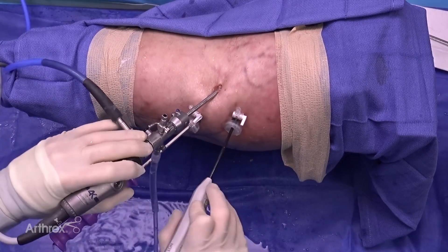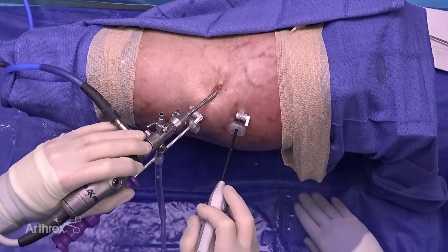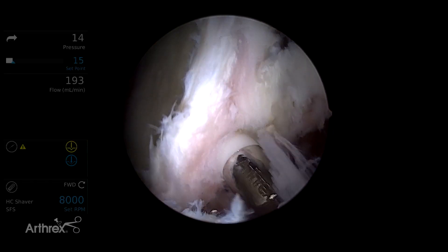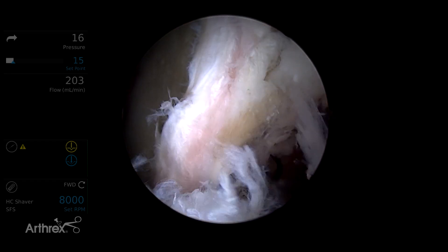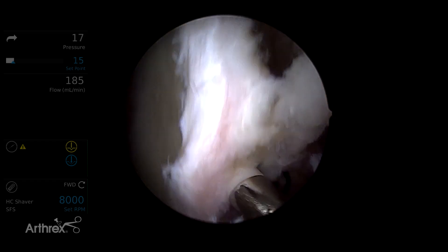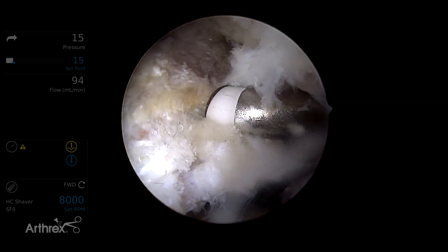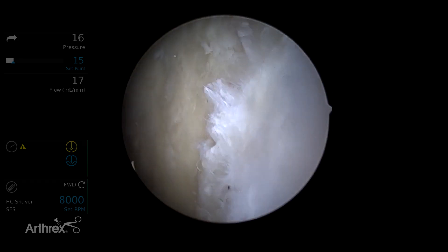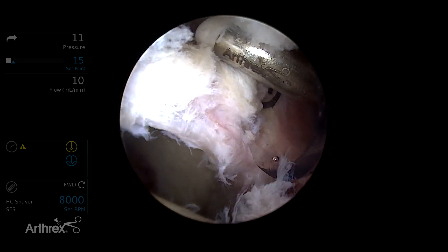I'm viewing through the mid-anterior portal with my instruments coming through the anterolateral portal. We've already prepared the acetabular rim. We have a labral tear extending from the 12 o'clock to 3 o'clock position, with 3 o'clock being anterior and 12 o'clock being superior. As you can see, the labrum is peeled off the acetabular rim. We have chondral labral junction damage — this is a labrum that is going to require repair.